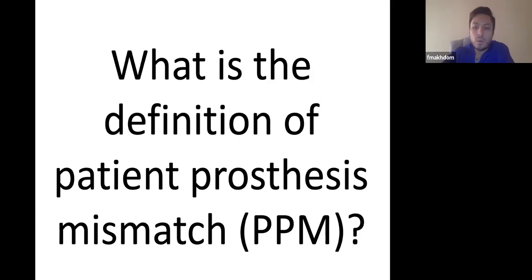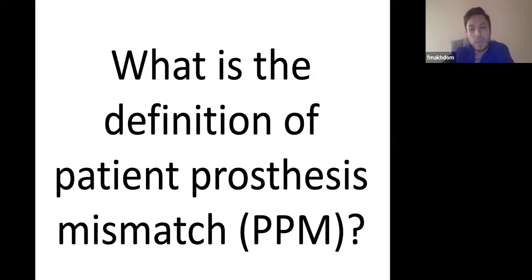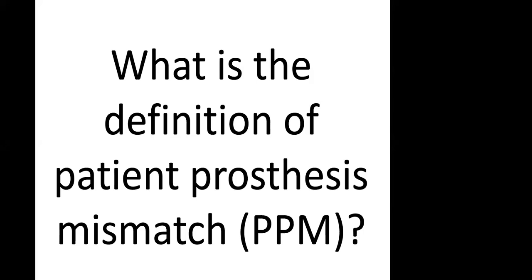So how do we measure it? Effective orifice area. Effective orifice area of what? Of the valve, of the prosthesis. Yes, right, divided by body surface area.